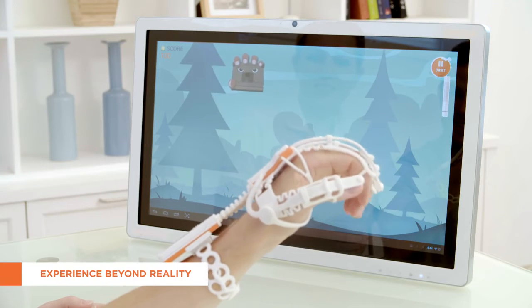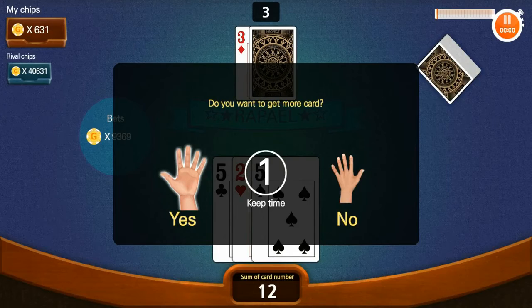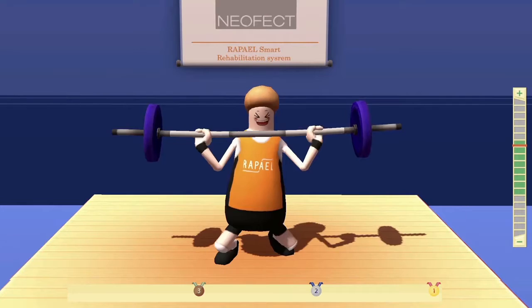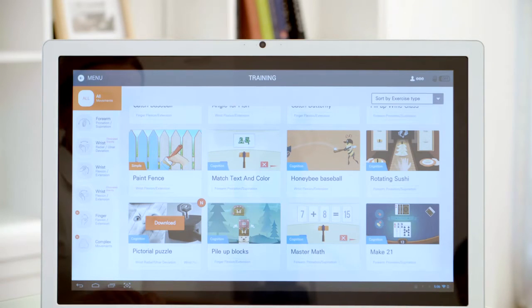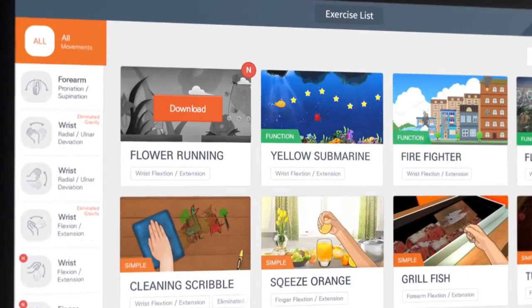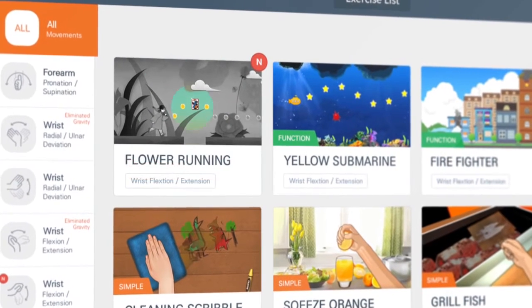Even under limited time, space and resources, a patient only has to connect to an application wearing Raphael Smart Glove. Then the patient will have more fun exercising under a virtual rehabilitation environment that he cannot experience in reality. In addition, regularly updated new training content offers new movements and challenges suitable for patients' taste and rehabilitation stage.